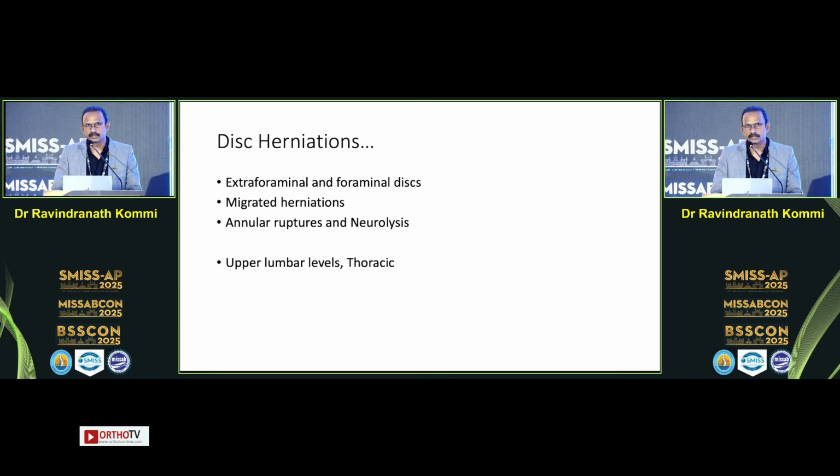For disc herniations, my focus is mainly on extraforaminal and foraminal discs, because these require a little more elaborate dissection and more elaborate procedures if you are an open spine surgeon or using microscope-assisted surgery. Whereas through transforaminal endoscopy, this becomes a very easy surgery. I may not say it's very easy, but over a period of time, it becomes very easy to operate these cases under local anesthesia.